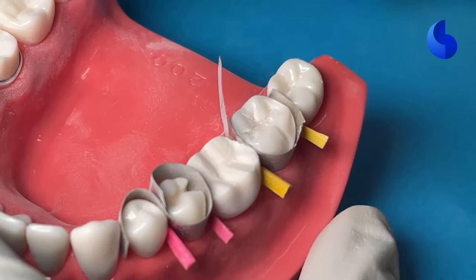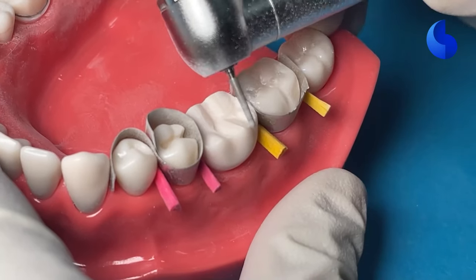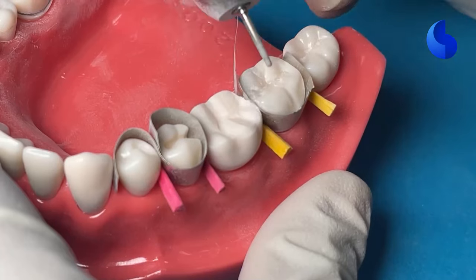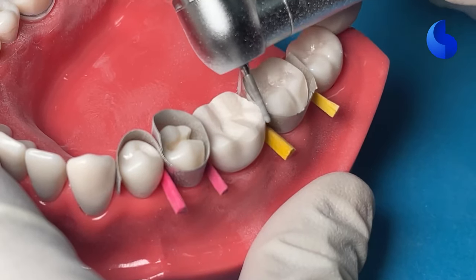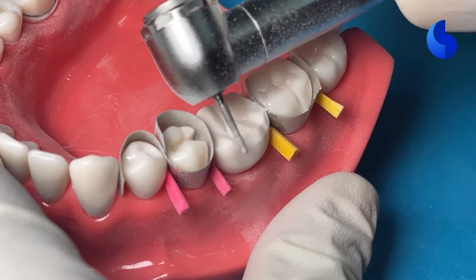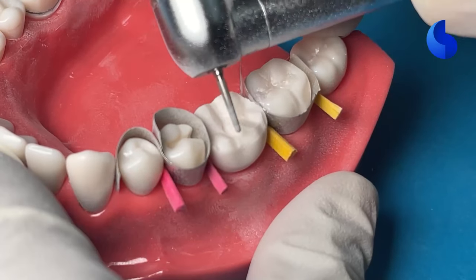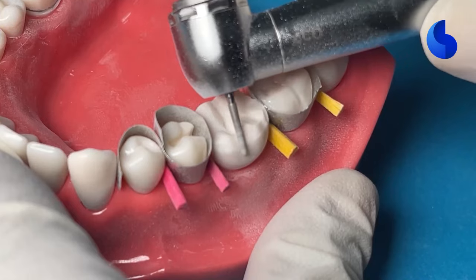the functional cusp bevel. Functional cusp bevel can also be done with the same burr that you've been using so far, 856-016. A good alignment method that you can use over here is keep your burr aligned with the buccal incline of the lingual cusp, and then transfer that over to your buccal cusp, which is the functional cusp in the mandibular teeth.